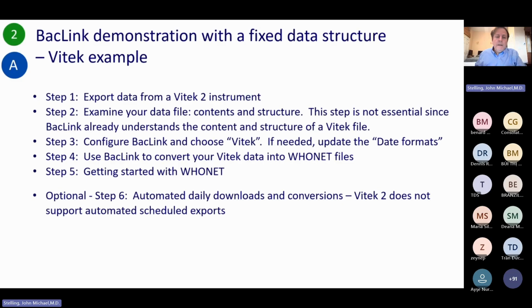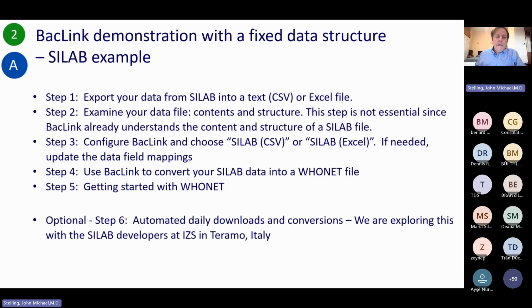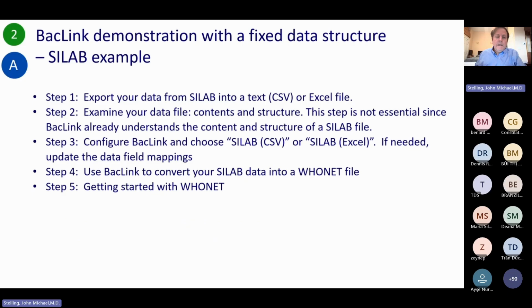And I already mentioned for the automation, you cannot do automation with the Vitek 2. It just doesn't have a button for scheduling. SILAB. I'm going to come back to this in a little while, but it is a review of what we did last time. That's why I don't want to lose more time on it now. I'll show you how to do a SILAB example.